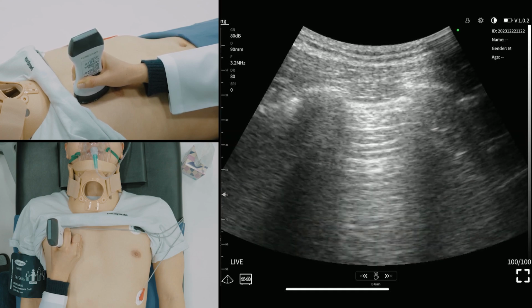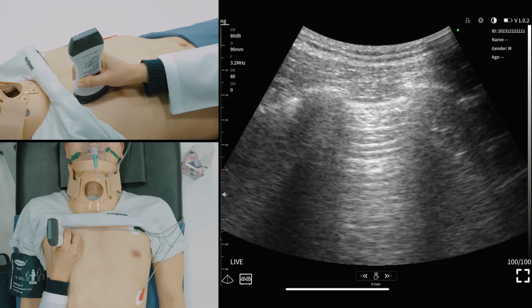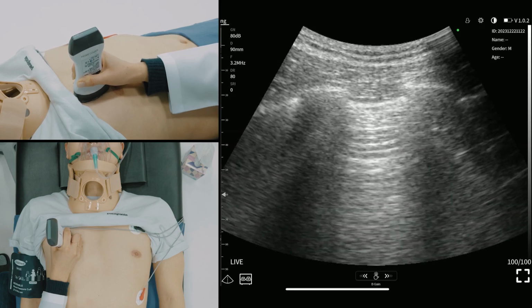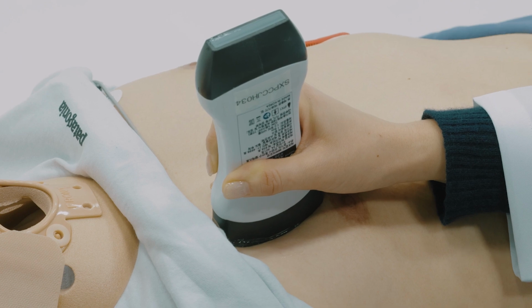Please ensure that we do not cease scanning after the initial findings, and maintain continuous observation of blood, volume increases, changes in heart function, etc., so that we can appropriately adjust the direction of patient care.